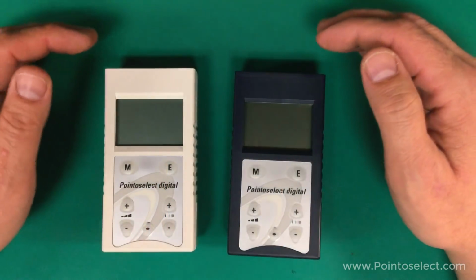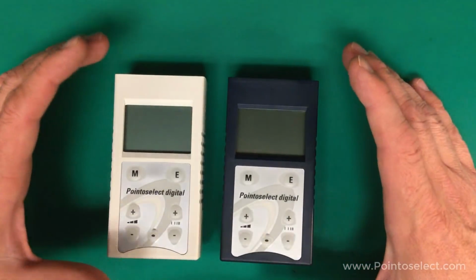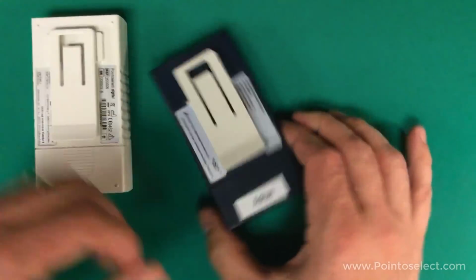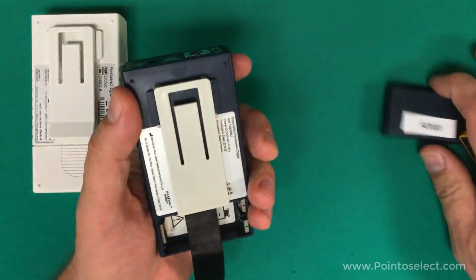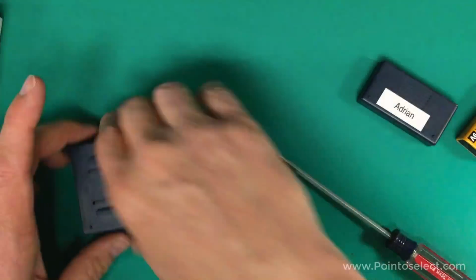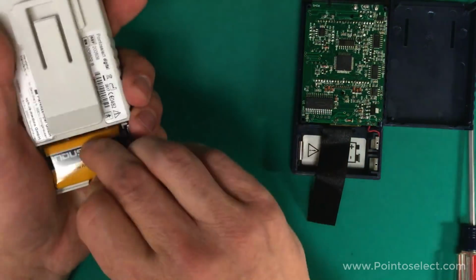Well, I have to admit, I'm intrigued at this point. I've got these two units, they seem to be exactly the same in every way measurable, and I've just got to know. So I'm going to go ahead and take them apart. Let's see what's inside. Let's see if they're the same in there. Starting with my own personal unit here. Okay, there we have that one. Let's do the same over here.